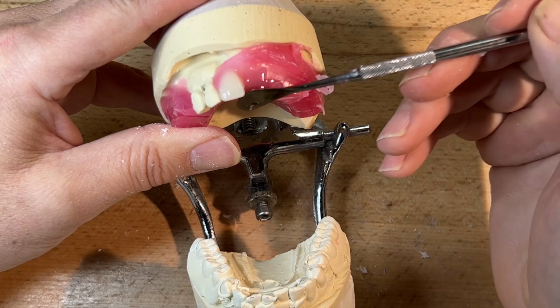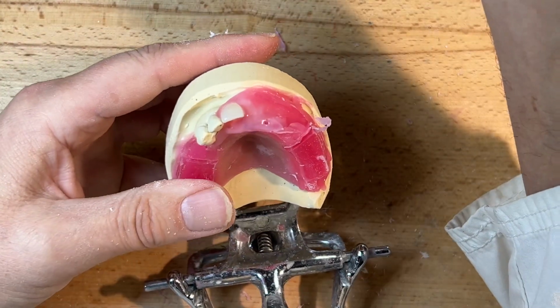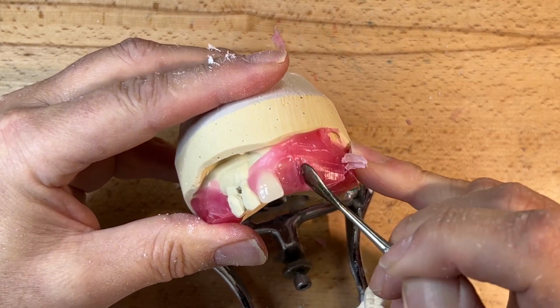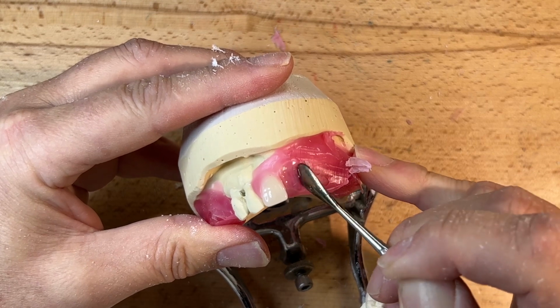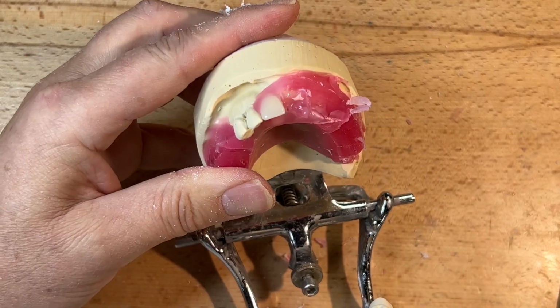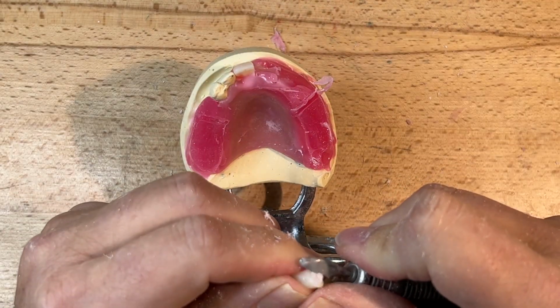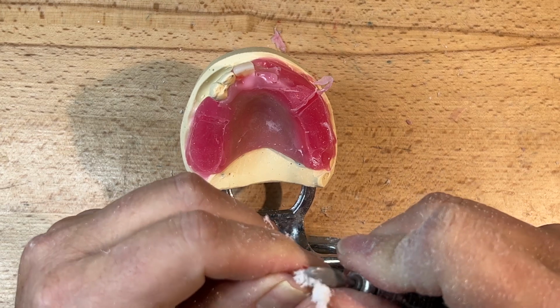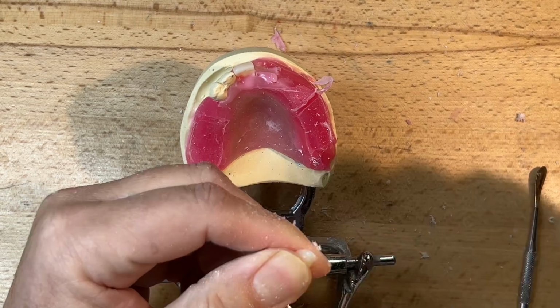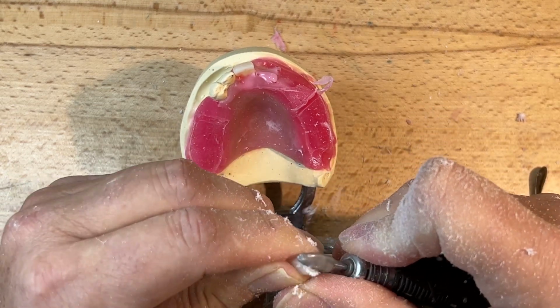I was pretty careful. My wax was homogeneous with the base plate. It didn't break off or split or crack or peel. Very straightforward. And then that gives me a lot of freedom now in the setup that I'm not really wasting time adjusting base plates. Like most immediate dentures, we have to manipulate the denture teeth, normally the ridge lap.